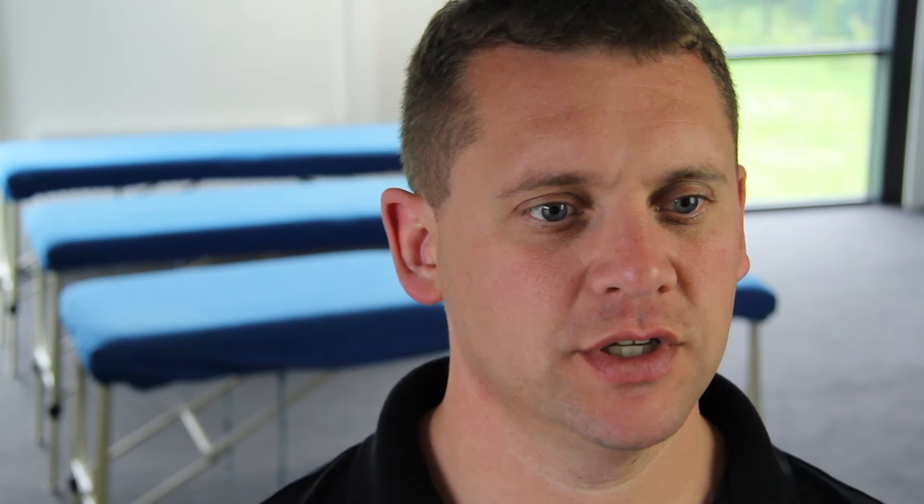Cohesive bandages are characterised by their capacity to stick to themselves but not the skin. They are hand-tearable and extremely useful in applying quick compression or absorption of blood in an acute injury. Examples include Vivo Rip, Power Flex, Coban and Mueller M-Lastic.